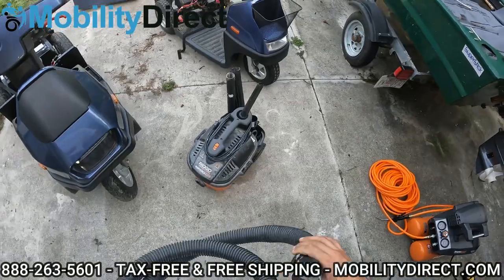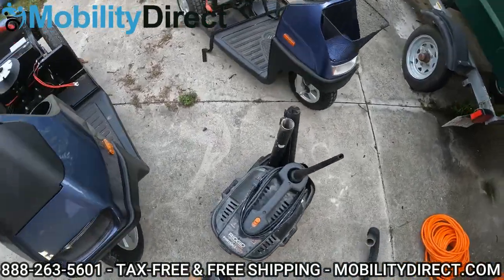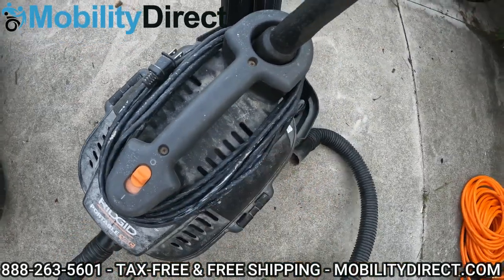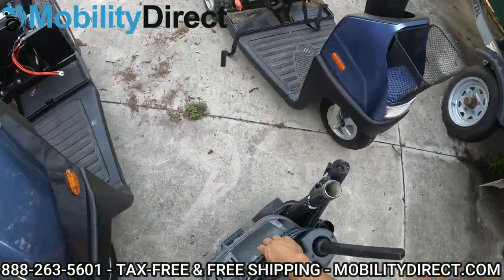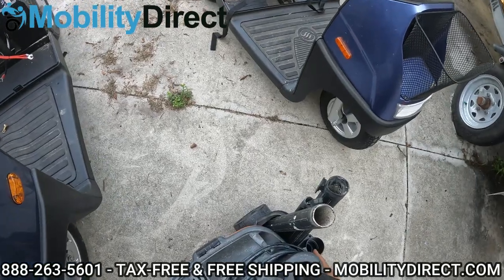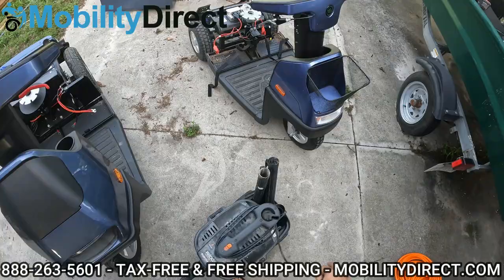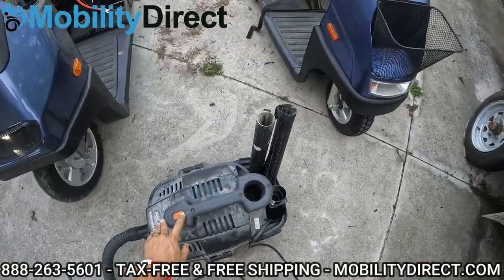All right, so I've got my four-gallon shop vac here, and I'm going to go ahead and get to town on vacuuming out some of that debris. If you have a shop vac, this is what I would do. You could also use any kind of vacuum cleaner, really. All right, let's let it rip.